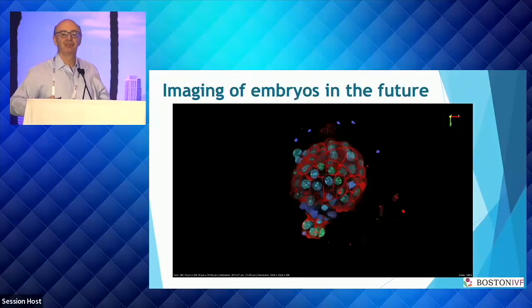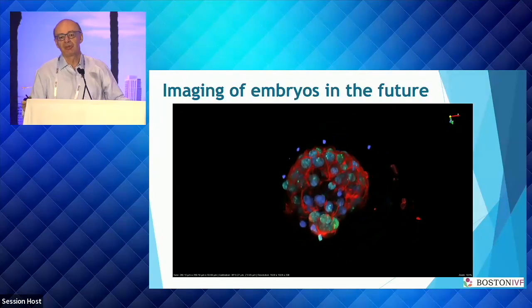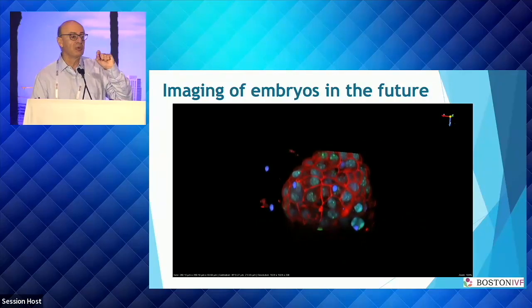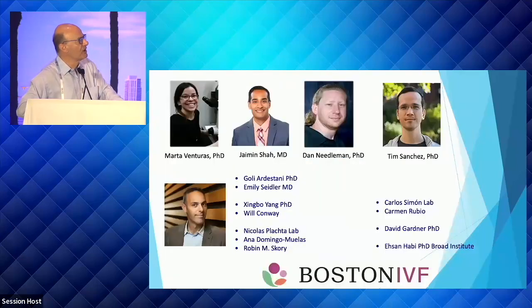So maybe in the future we'll be doing different confocal microscopy, we'll have different markers. We could probably do this now under light microscopy. There are technologies out there. I think imaging of embryos in the future will be very important and will be very different from how we do it now using embryoscopes or the Geri.